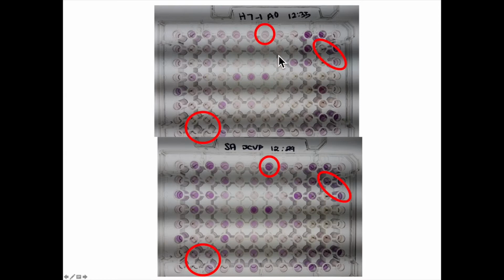And if now we look at the circles, this is just showing you that Staphylococcus aureus can ferment the sugar, but this bacterium cannot. Okay, Staphylococcus aureus tests positive for these assays, and this one does not. And same thing down here. They test positive for these assays, and this does not. So this is just an example of how two different kinds of bacteria have different patterns on this BioLog Gen 3 plate. It's called a phenotypic assay. And that allows you to then run that pattern through a database and ideally identify that.